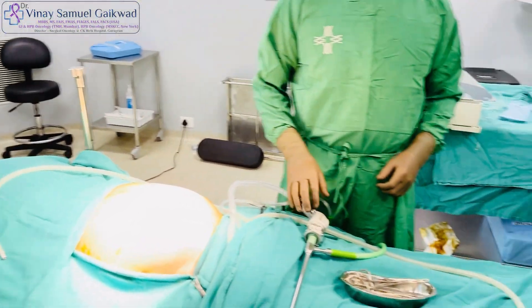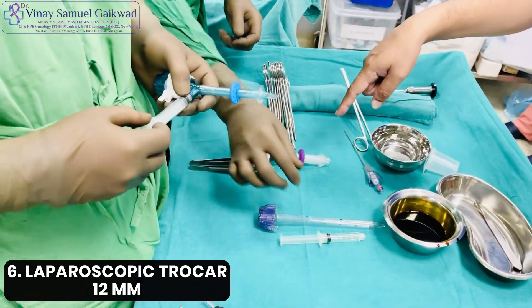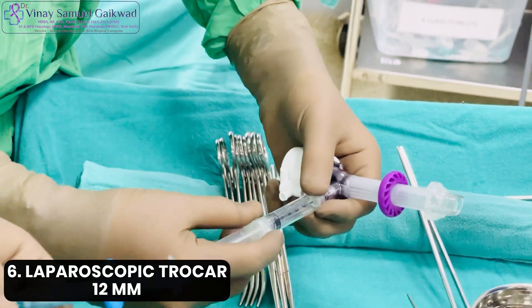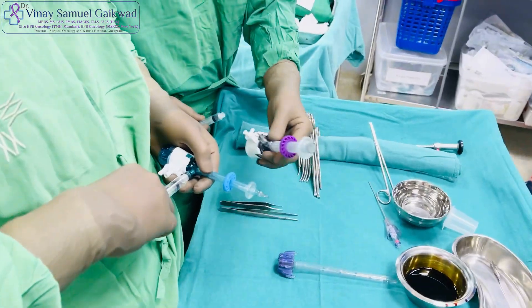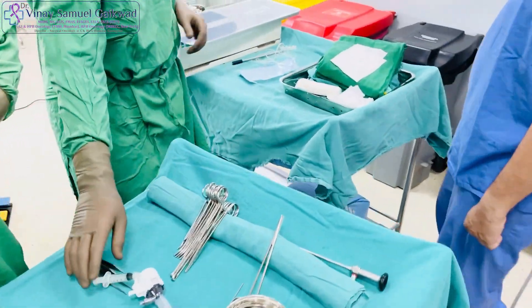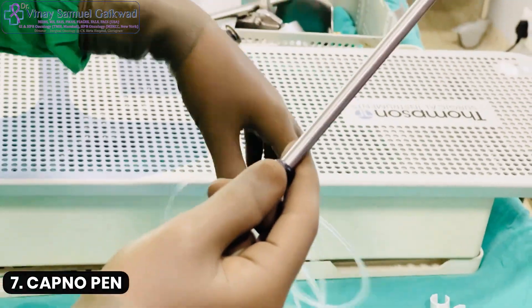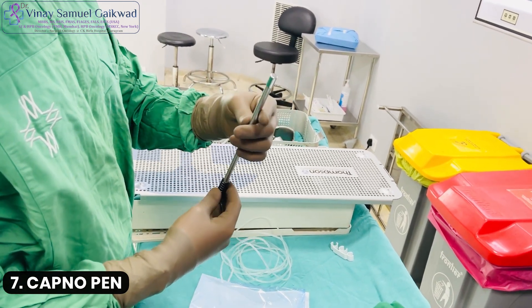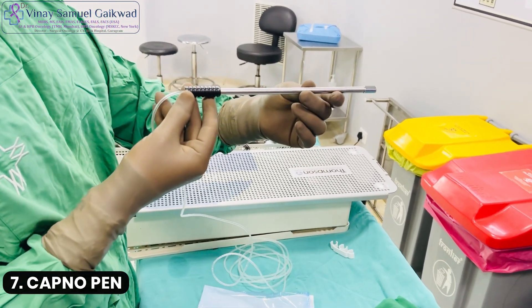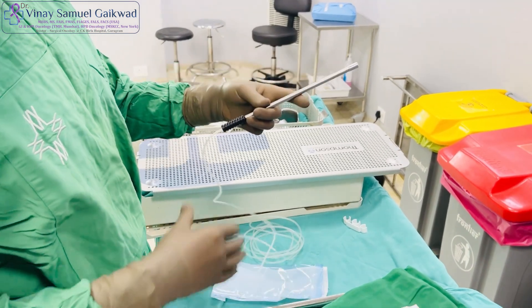You need balloon trocars — one 12 mm trocar with a balloon which is insufflated, and a 5 mm trocar. Last but not the least, you will need a capno pen. This is what atomizes — it's a nanoparticle device that converts the liquid chemotherapy to a gaseous form, and this is really the crux of the whole procedure.